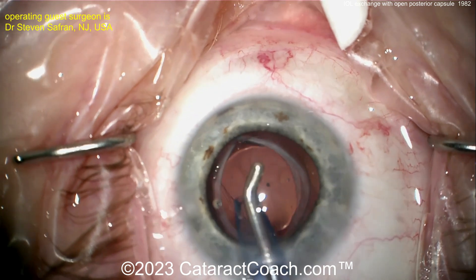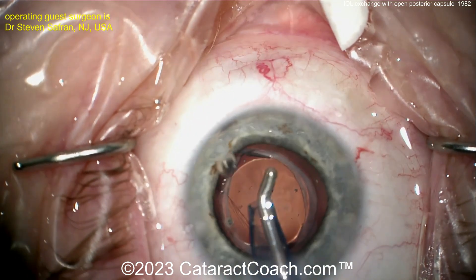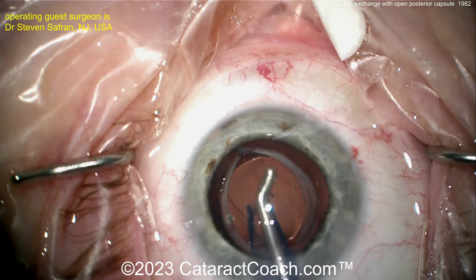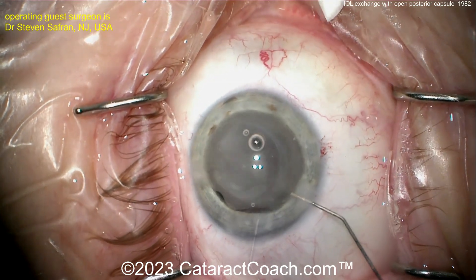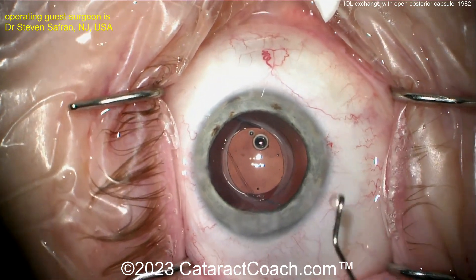Now viscoelastic removal — be very cautious here. Remember the incision is extra large, so it may cause excessive leakage; you don't want prolapse of any contents. Remove the viscoelastic without allowing vitreous to prolapse. Dr. Saffron is doing a good job — nice and controlled. Triamcinolone is placed in the anterior chamber to check for vitreous, and there's no prolapse. The lens is very well supported despite the open posterior capsule.